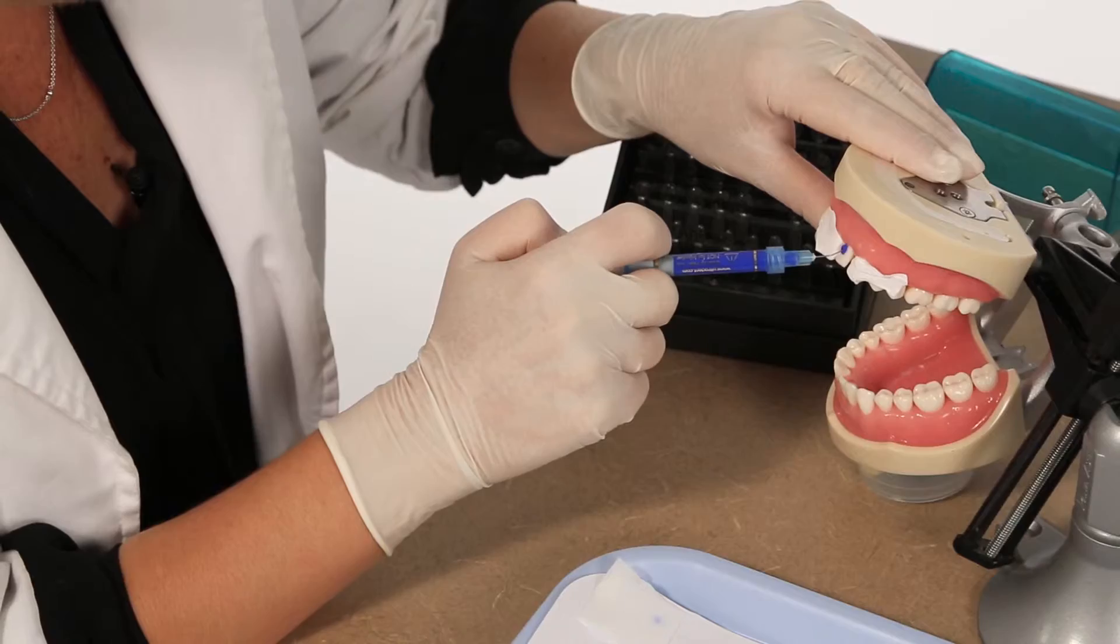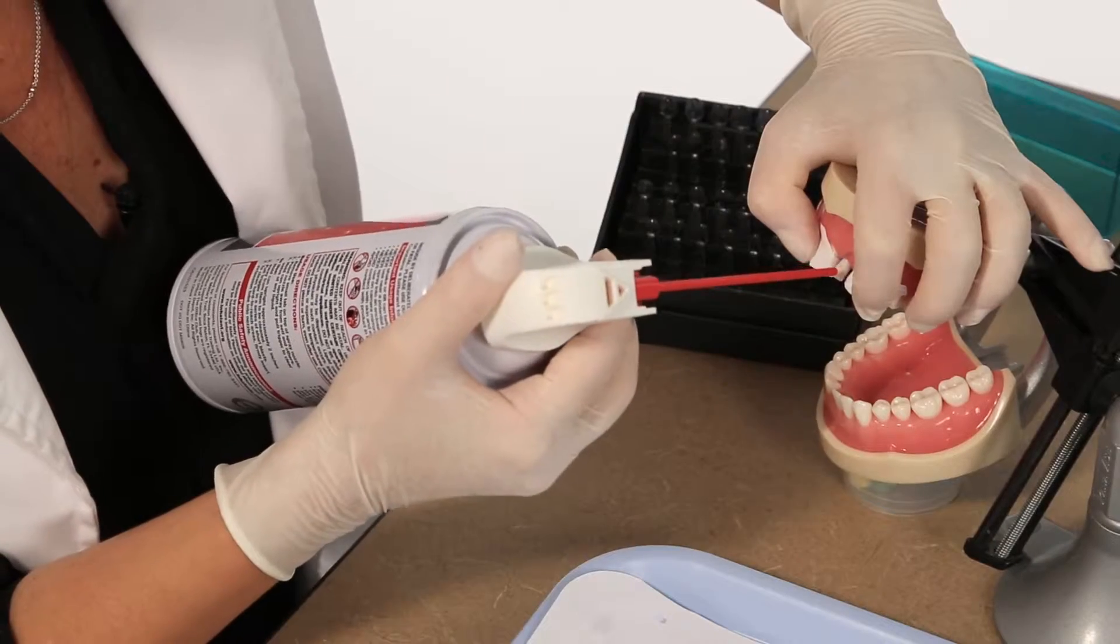After separators are placed, etch the tooth for 20 seconds, wash, and dry.